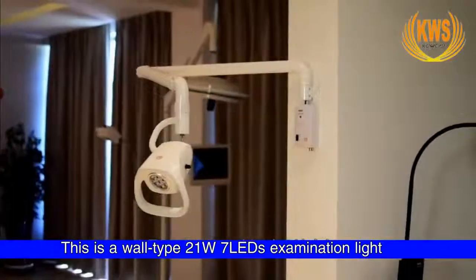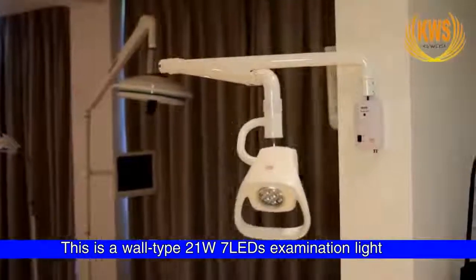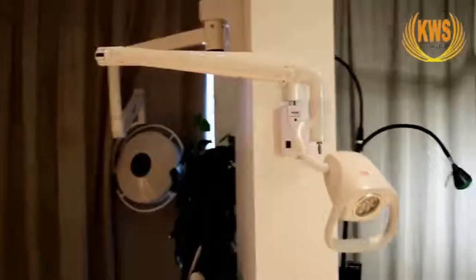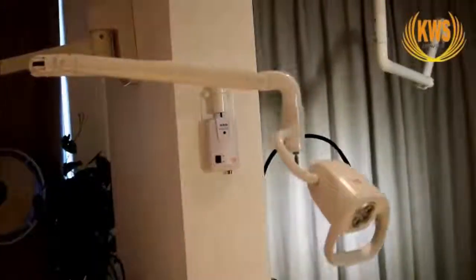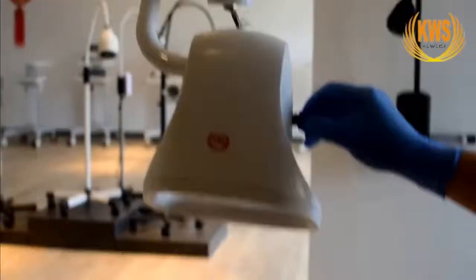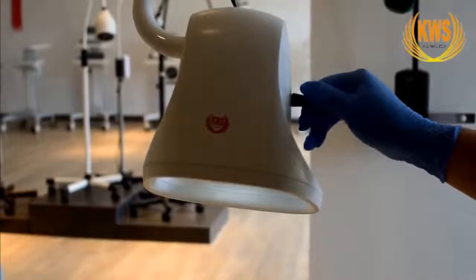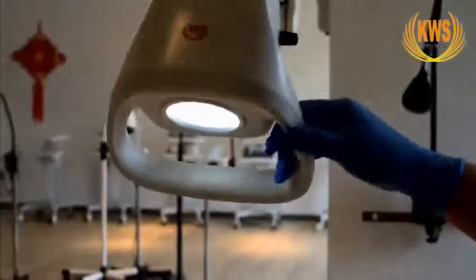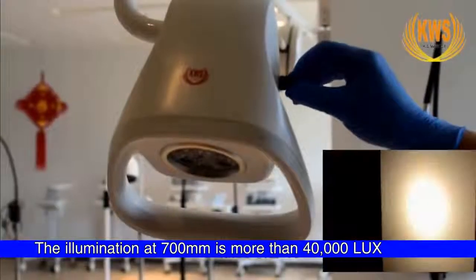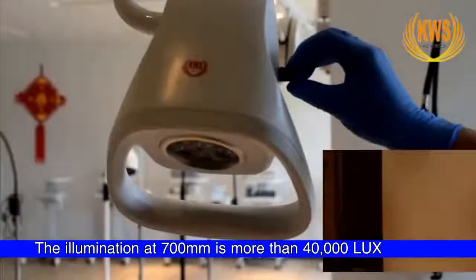This is a wall-type 21W 7 LED examination light. Turn on the switch for linear adjustment of brightness. The illumination at 700 mm is more than 40,000 lux.